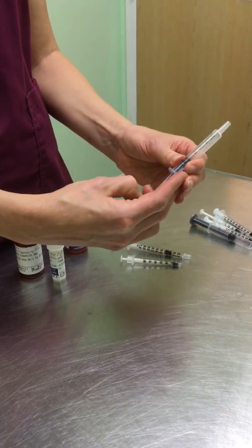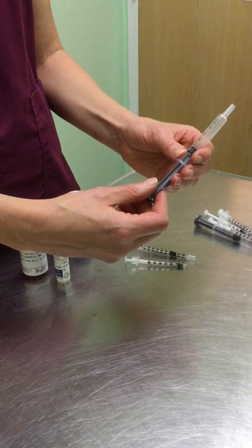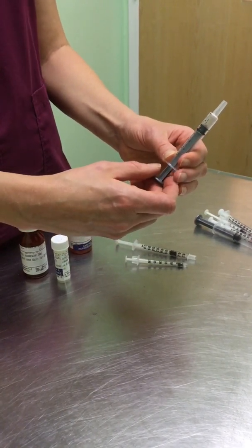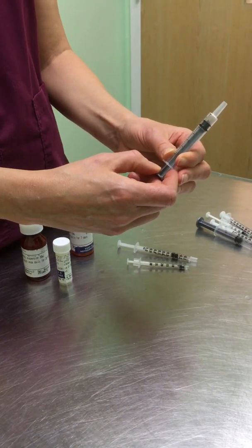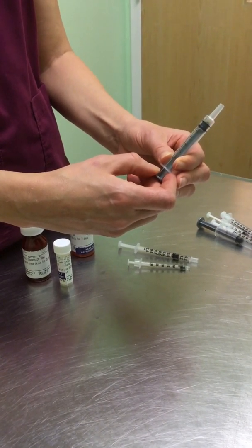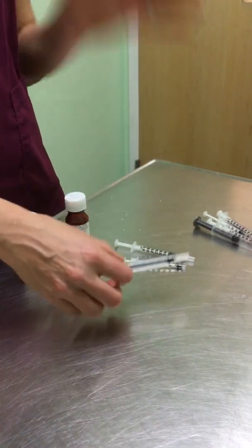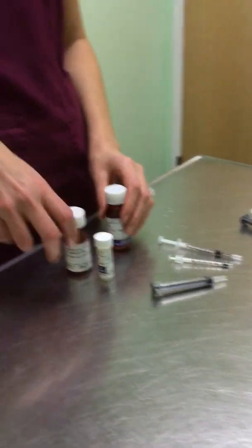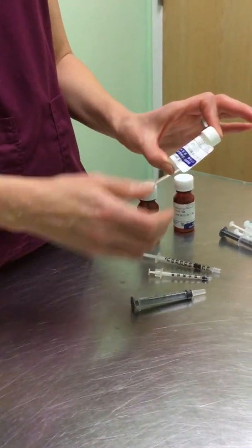And then this is a 3 ml syringe. And again, for reference sake, if you wanted to know what 0.3 is, you would go to the 0.3. So here's a half a mil, which is 0.5. So 0.3 would be to the third little line, just to give you guys a basic lesson on how these syringes work. So some examples might include getting a medication like this.